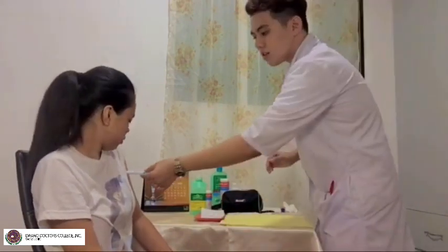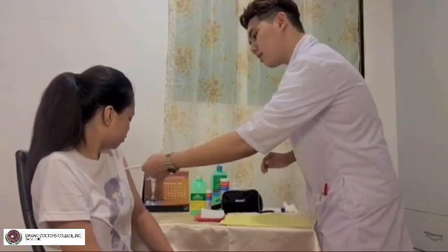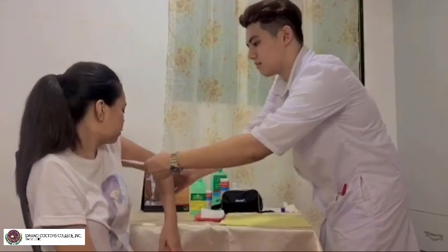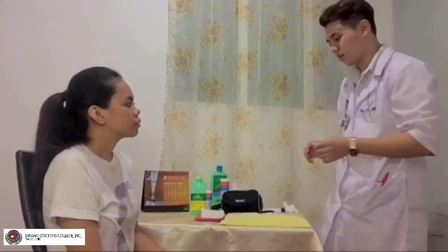So, since the thermometer has already its result, okay, so pwede na nakatanggalon, ma'am. Okay, okay. Salamat kaayo, ma'am ha. So, imong temperature karon kay 36.9, okay? So, the normal kay, ang normal jud kay 36 degrees Celsius to 37.5 degrees Celsius. So, 36.9 man imo, so under normal ka, okay?